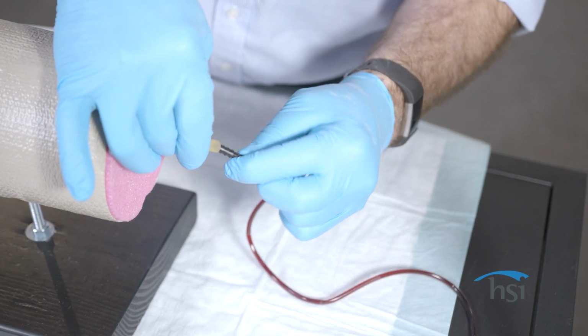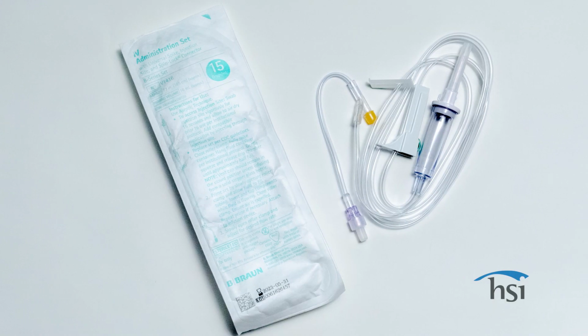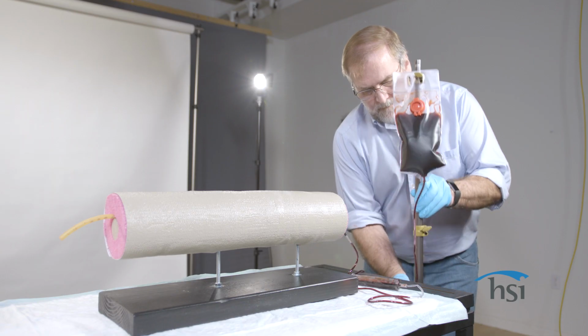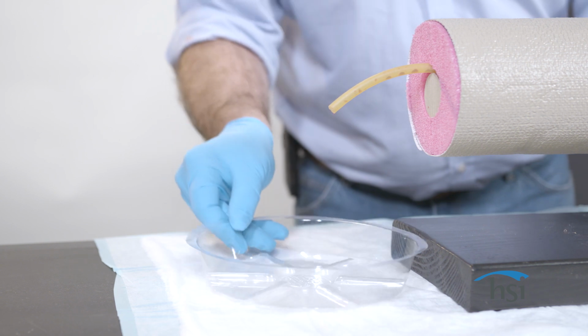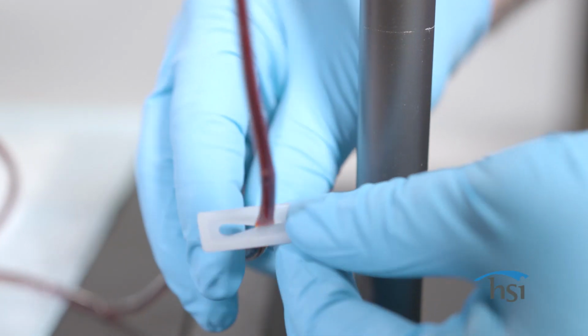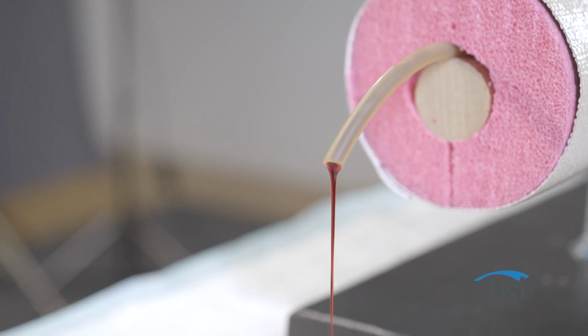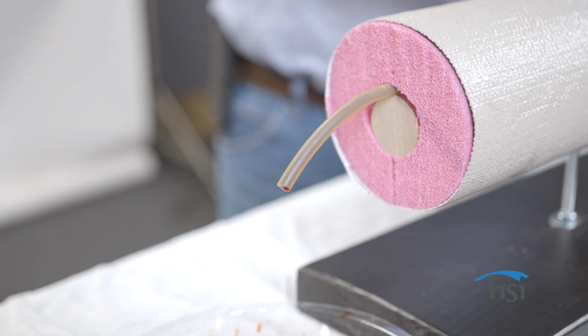Attach one end of the tubing to a clamped off container of colored water. An IV administration set works great, or you can improvise using something else. Elevate the container above the level of the prop and position the other end of the tubing to run off into a receiving container. Unclamp the tubing and allow the water to run freely through the prop. This simulates blood flow. A properly attached tourniquet should stop the flow of water through the tubing.